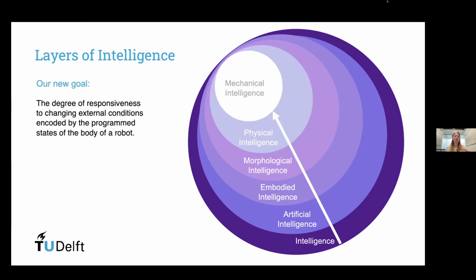However, they're still limited in what they can do. Similar to what the previous talk said, they can't really adapt to all the shapes that can be found in the body, and they're sort of a general solution for everything. But what we want to achieve is to control the properties of the catheters or the guide wires to improve this.